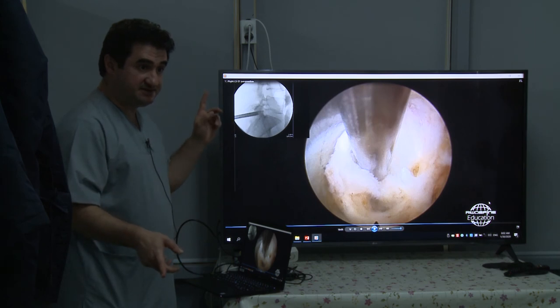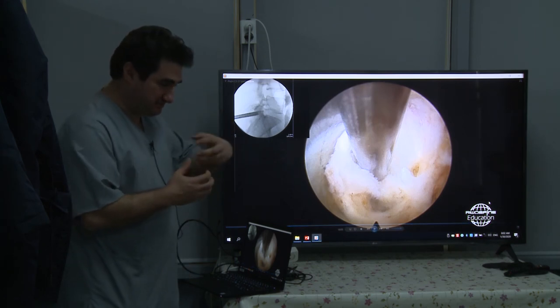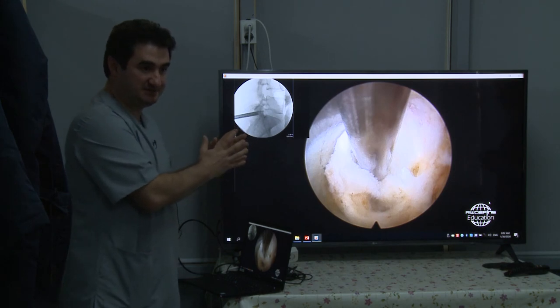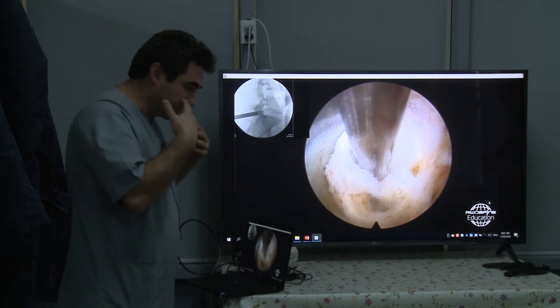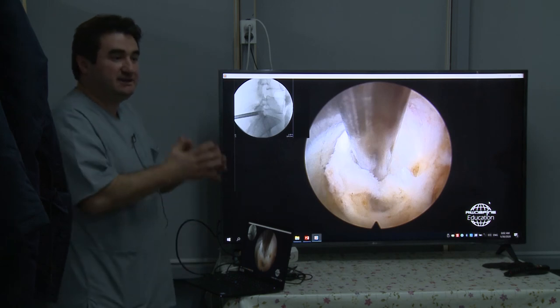With sequestration, cranial or caudal sequestration, of course you can do it, but at the beginning, before getting the handling, yeah, it's better to stay on the disc level. Otherwise, you need to look cranial, caudal. It's really easy. You can do it later. But to start, our recommendation is on the disc level. Then you can easily do it.